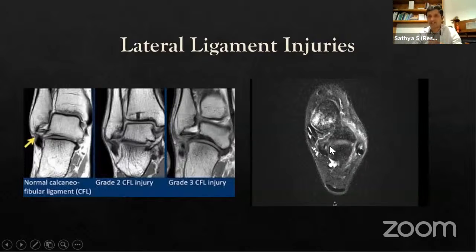I sent her for an X-ray. Initially, the X-ray didn't rule out anything, but the MRI did show us the presence of a microtrabecular fracture of the head and neck of the talus. Also, there is injury to the ATFL. We can see how the ATFL is present here. You can see it is completely hypertrophied now. It is not a black line anymore, and that shows us this person has had an ankle injury in the past. She is still in the moon boot, or CAM walker, at the moment. We are expecting her to be off it in the next week or two.